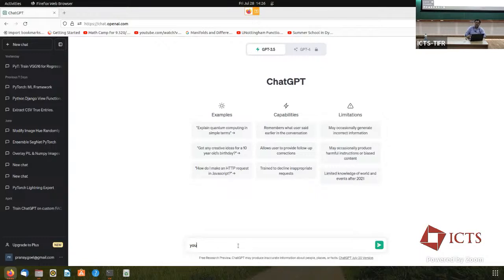I assume you all know how to use ChatGPT, right? Who has not used ChatGPT in this room? No, well, you should learn it. There's lots of people who used it. Time to switch. So my prompt is up here. If anyone can't read it, please let me know. You are a Python developer.